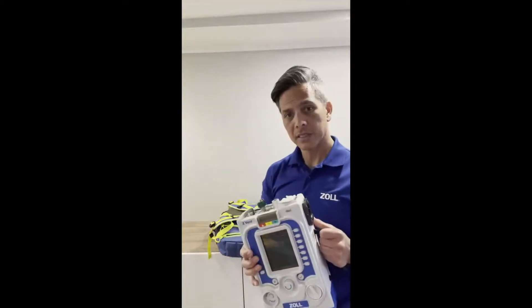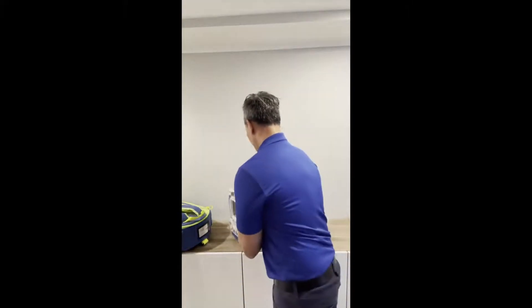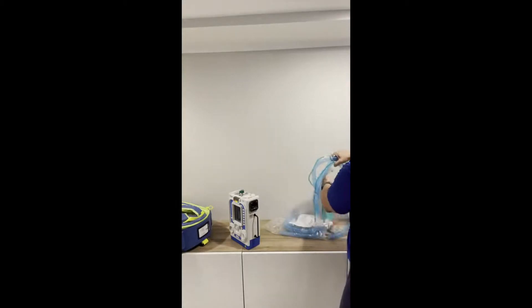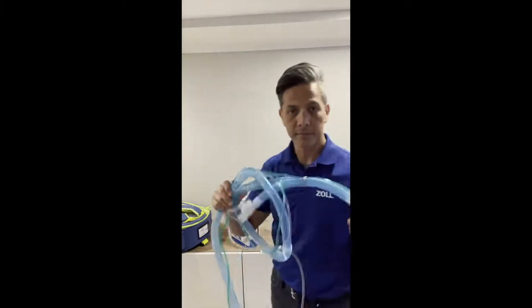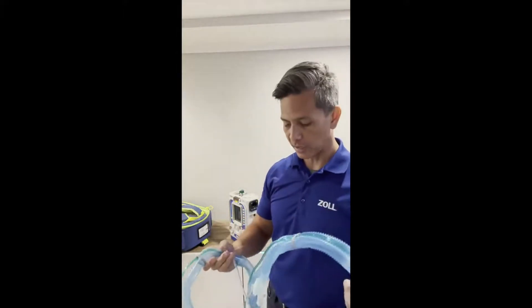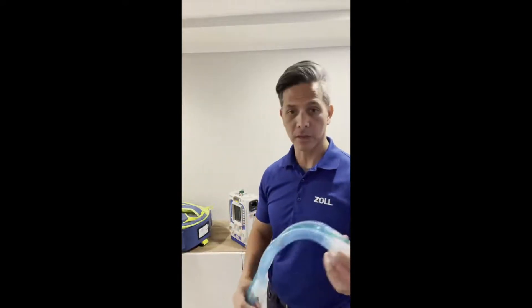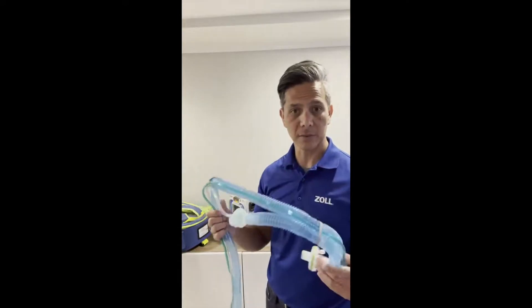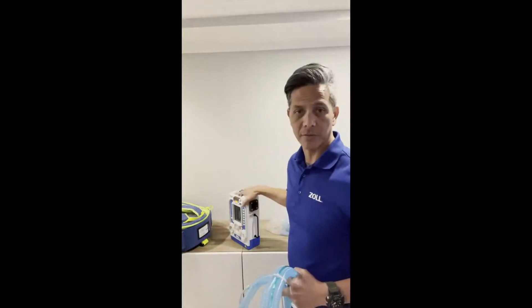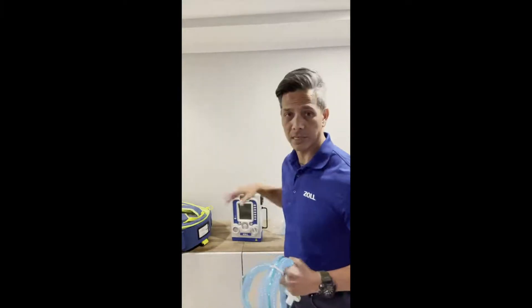So let's go ahead and show you what this vent can do. Taking a circuit right out of the package — this is your go-to circuit every single time. It's an adult/pediatric circuit that goes from 200 cc's of volume all the way up to 2000 cc's. The vent is currently rated as a 5-kilo vent and all the way up.